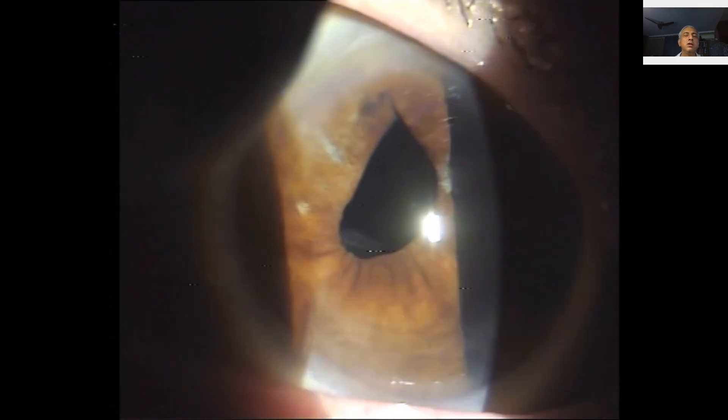In this slit examination, you can see the slit on the surface of the cornea, but you cannot see any reflection from the surface of the lens where the lens should have been. If there's pseudophakia, you'll get a brighter reflex in that area. If you do a double light reflex using a torch, you should not see that double light reflection.